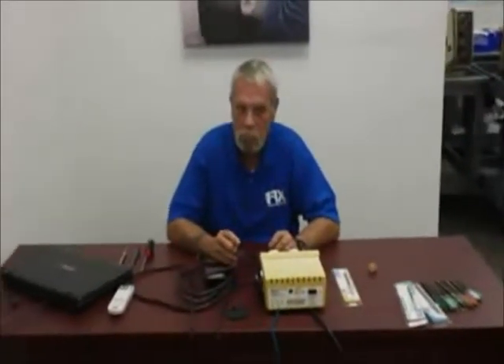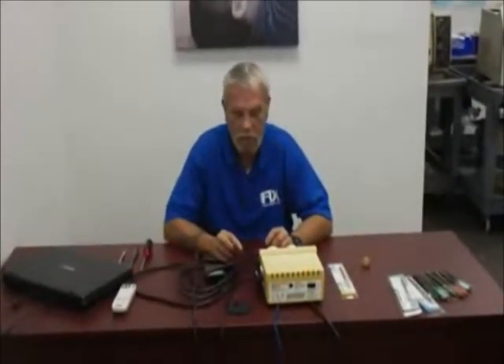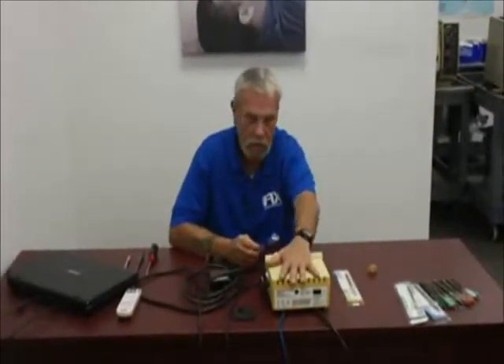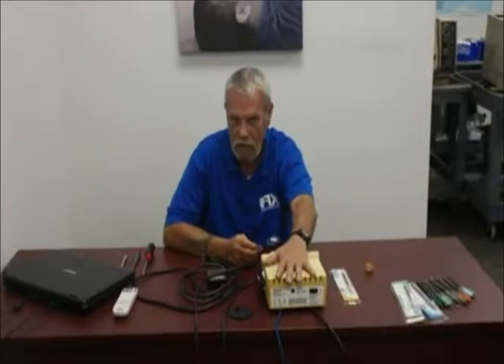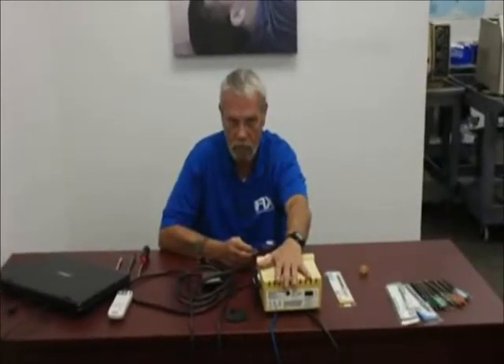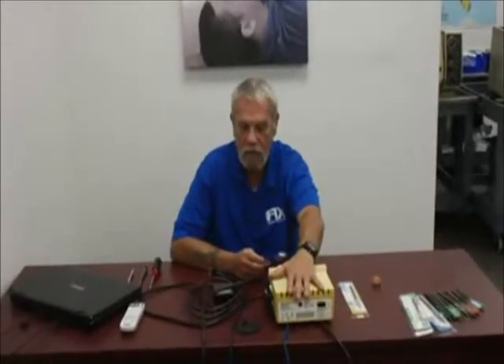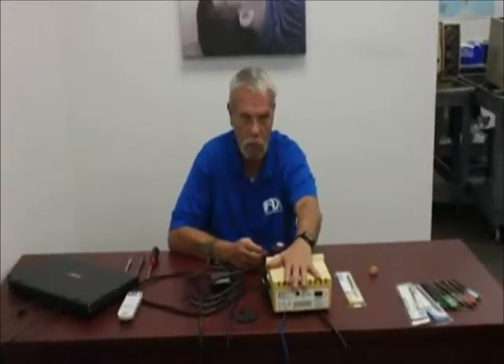Cavitrons look more intimidating than they are. Do not be afraid of them. If you have plumbing and electricity in a small box, there is no reason to be afraid. They can be diagnosed easily and quickly and can actually make a good account for you.